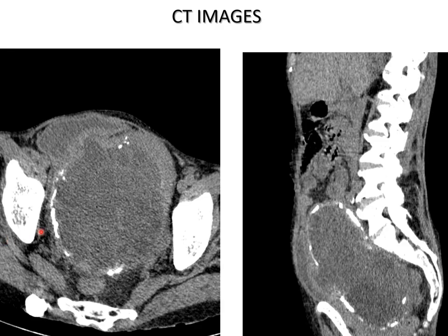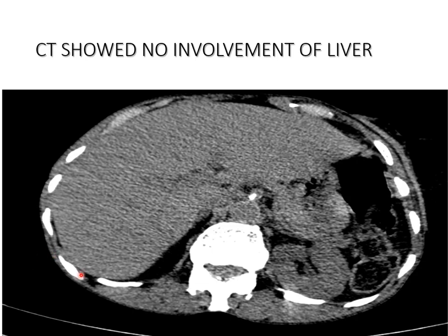Axial and sagittal plane CT images showing a solid cystic lesion with peripheral calcification and fistulous connection. Axial CT scan confirmed no involvement of the liver.